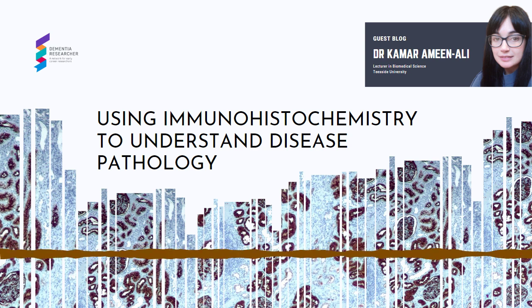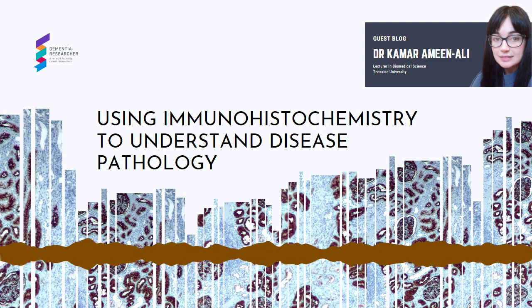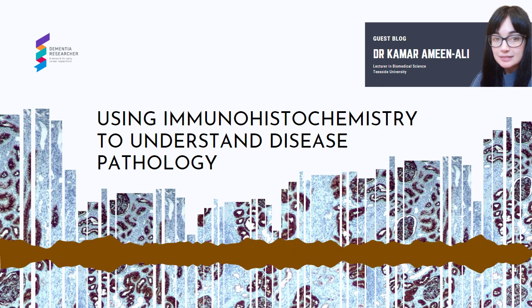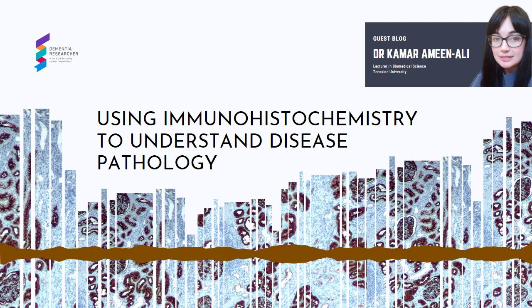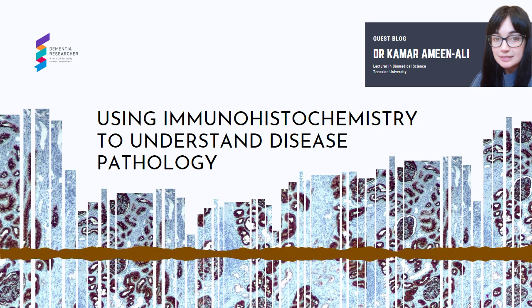As you cannot visualize the staining until the last step, because this is when the colour reaction happens, you will not know until the end of the protocol whether or not the staining has worked as expected. So depending on what the outcome is, you will need to use your knowledge to determine at which step the process may have failed. So I'm sure the question you're wanting to ask me now is, why would anyone use this technique? It sounds like a big headache. This is certainly true, and I've lost many days and weeks to optimizing protocols and troubleshooting.